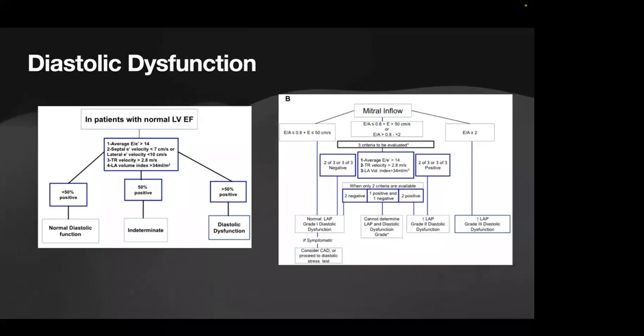Yeah, of course. I'm just looking at the chat here. Dean says, how about pacemaker? Yeah, so pacemaker activation can also affect your tissue depolarization. While it's not commented on specifically, like there are a lot of pathologies that they talk about, the guidelines do recommend that if you are someone who's getting paced all the time, the assessment of your diastolic dysfunction may be limited because of the activation of the pacemaker, presumably from the right apex.